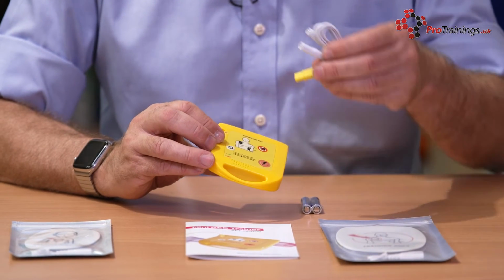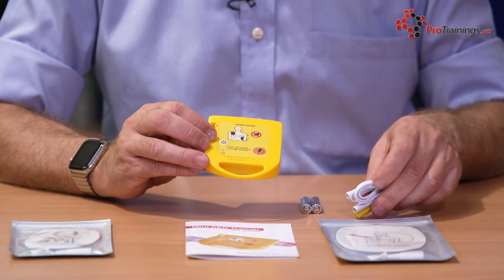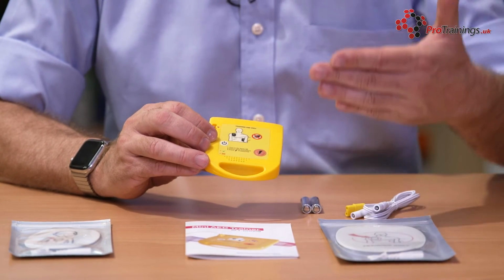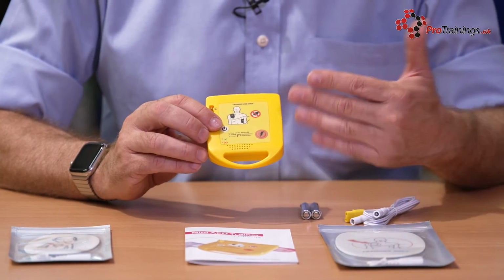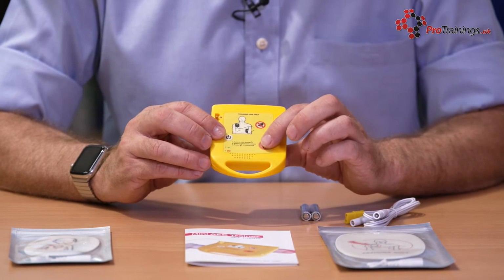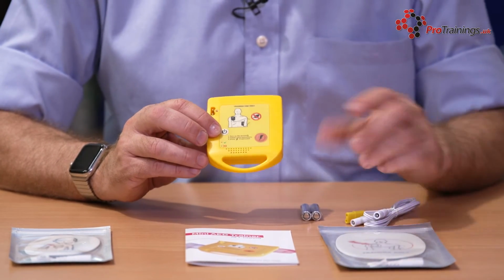When the pads are on, they then plug the pad lead in. When they plug the pad lead in, the unit will know the pads are detected, so it will switch to the next scenario. It will go through and it will look for a shock for the first time. So students will have to push the button, and it will tell you push when indicated. You push the button, gives the shock, and then they'll continue their CPR for 2 minutes.